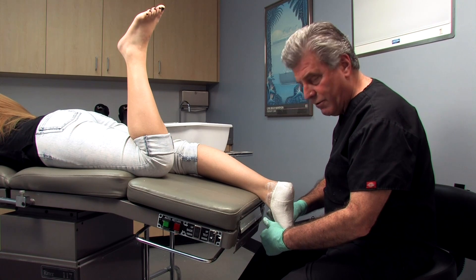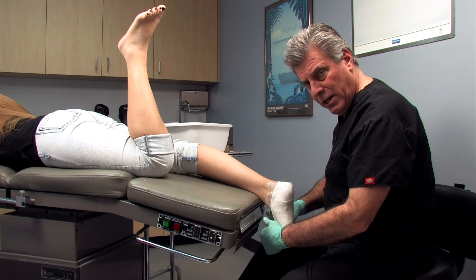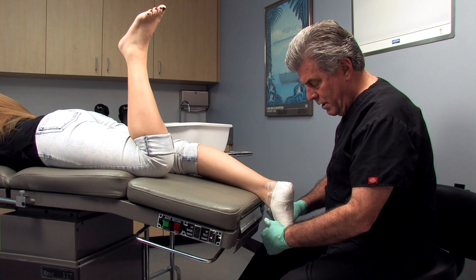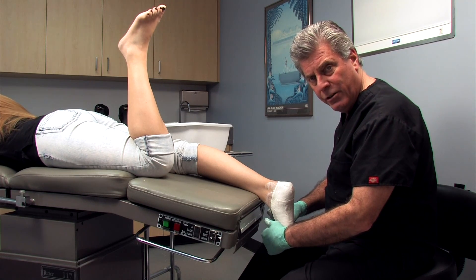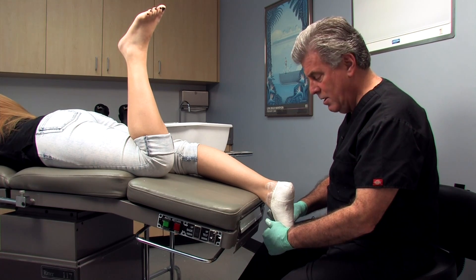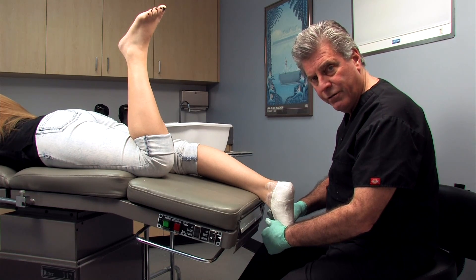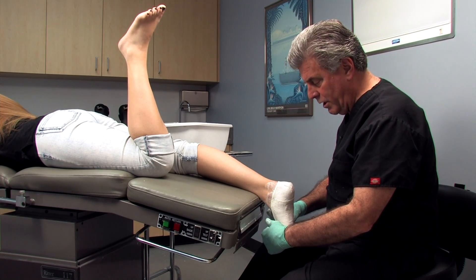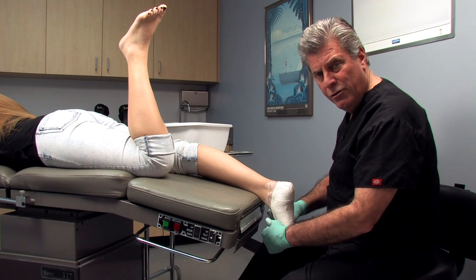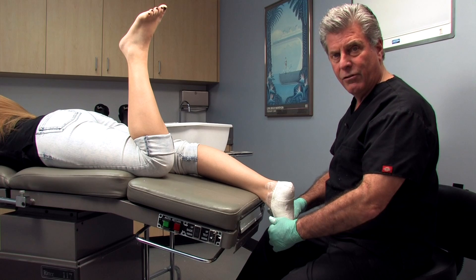Pulling down on the first metatarsal also reduces any supinatus deformity that might be present. The drawback to this technique is that pushing your thumb into the fifth metatarsal head — the only way to adequately load the mid-tarsal joint — is going to leave a little dimple in the cast, which could distort the plane of metatarsals one through five. So after we get the cast off the foot, we're just going to push inside the cast and remove that dimple, giving a more accurate representation of where that fifth ray actually was.